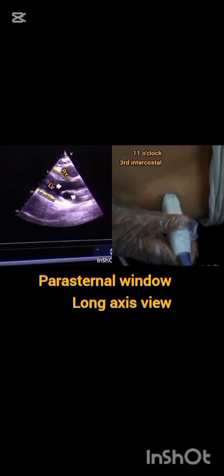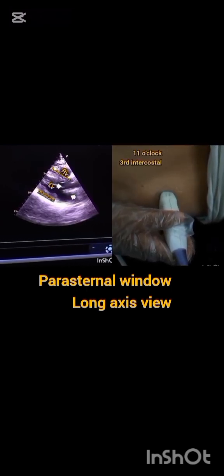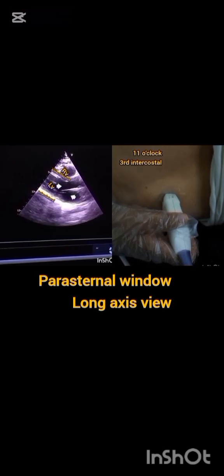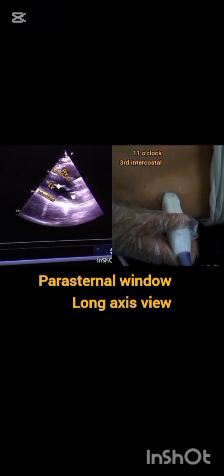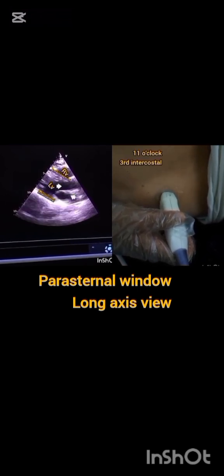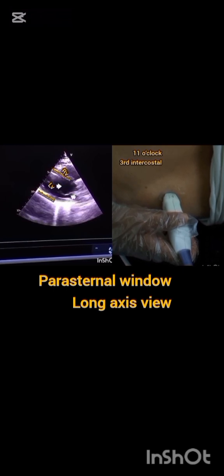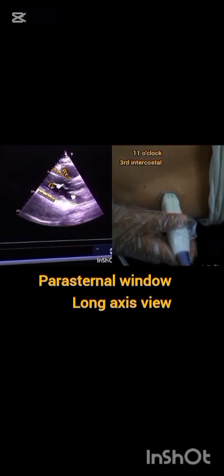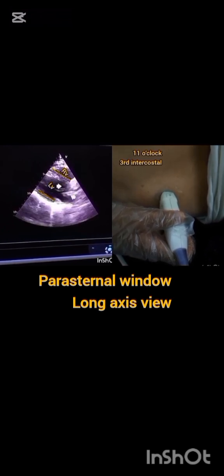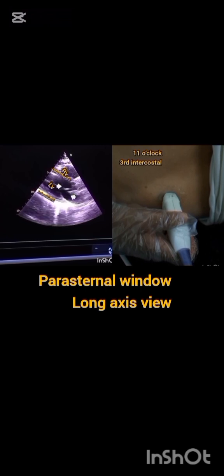The patient is best imaged lying on his left side with the left arm under the head. Place the probe in the third or fourth intercostal space just left of the sternum with the indicator marker pointing toward the patient's right shoulder, at 11 o'clock. Minor adjustments in probe position, tilt, and rotation are often needed to align with the heart's long axis for optimal visualization of the left ventricle, aortic valve, and mitral valve.